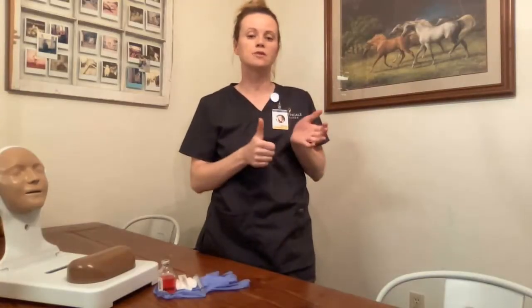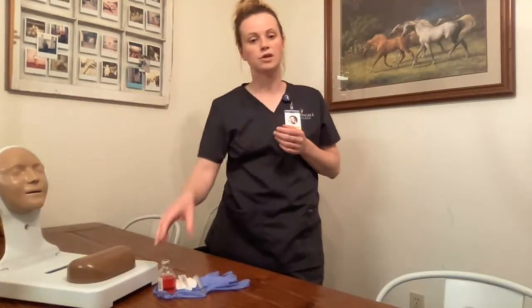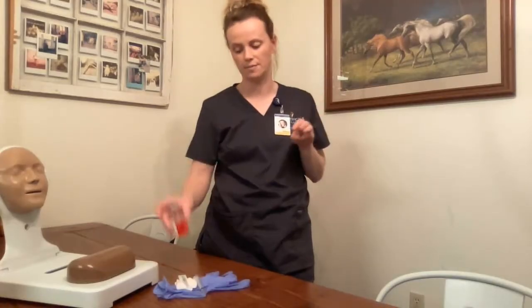Next, I will verify the six rights of medication administration: the right patient, right medication, right dose, right route, right time, and right documentation. After verifying those six, I will check the medication ordered in the EHR and verify this medication against the MAR. I have to do that three times before ever giving medication to a patient, so this is my one out of three times.